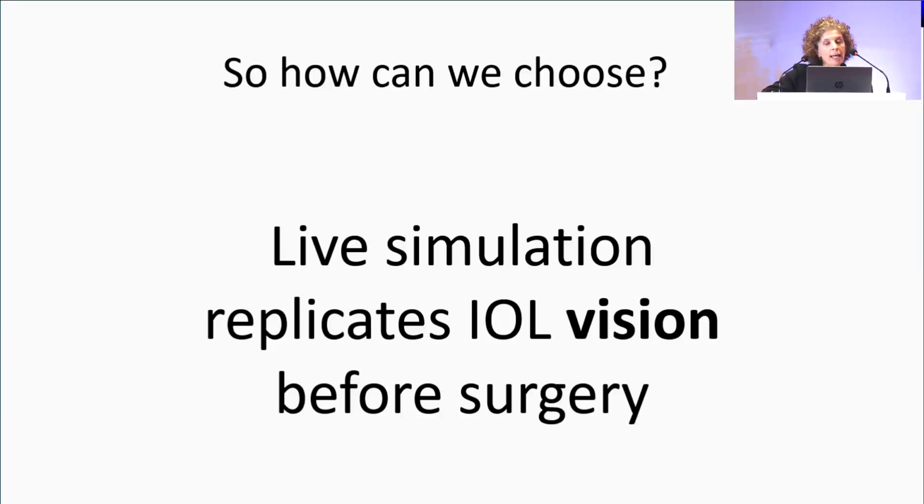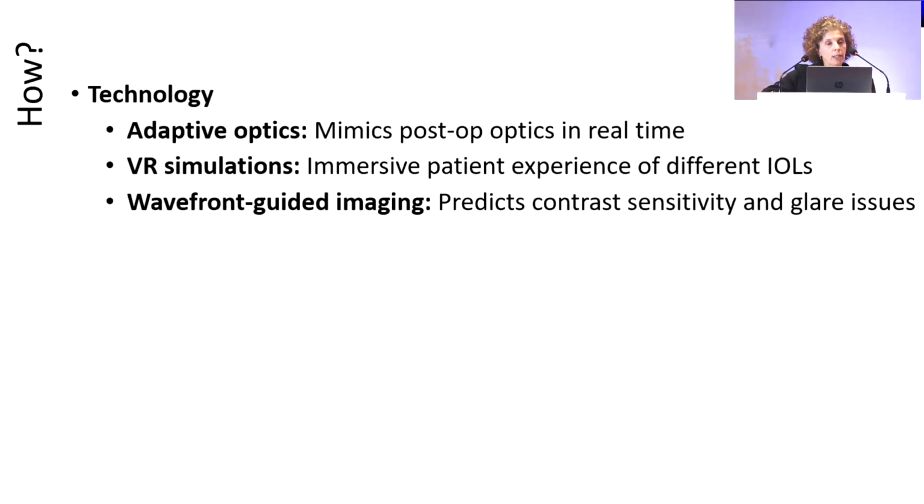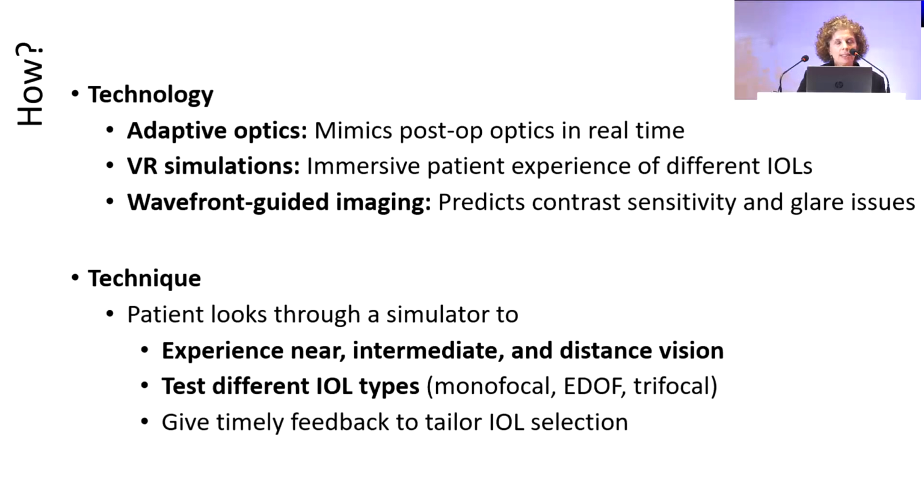Our proposition is to introduce live simulation to replicate what happens as if the IOL was already in place before surgery. It relies on technology supported by adaptive optics, which mimics post-operative optics in real time, virtual reality simulations, which can provide this immersive experience to the patient as if he or she is already using the IOLs, and also wavefront guided imaging as a technique. We will see in a minute.